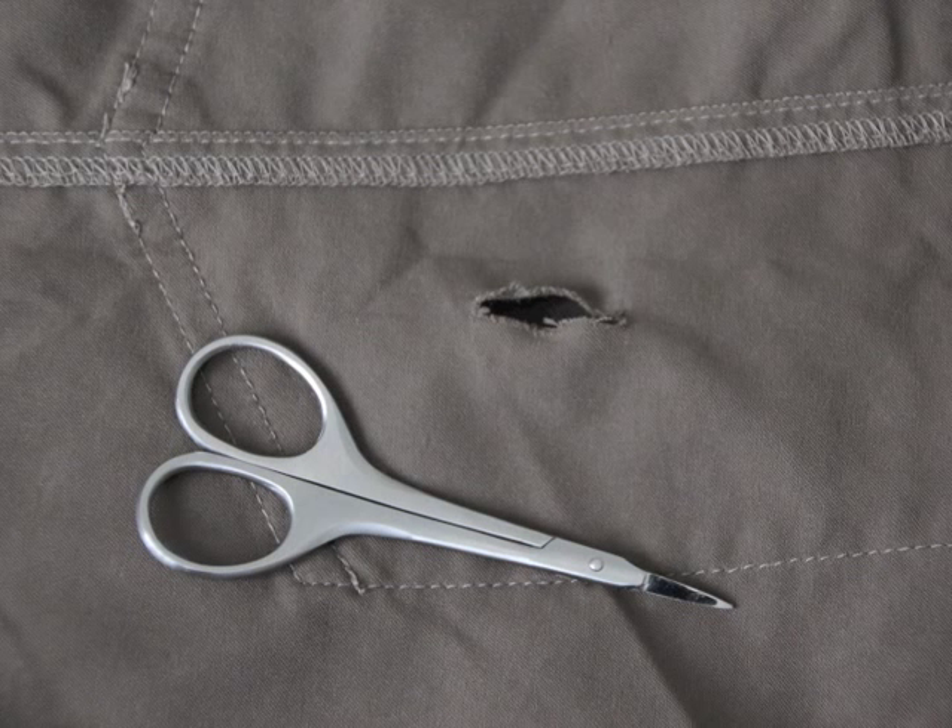Cut a small slit or hole on this side of the pocket. It should be about 2 inches. Be careful not to cut it at the bottom of the pocket so that small things won't fall out later.